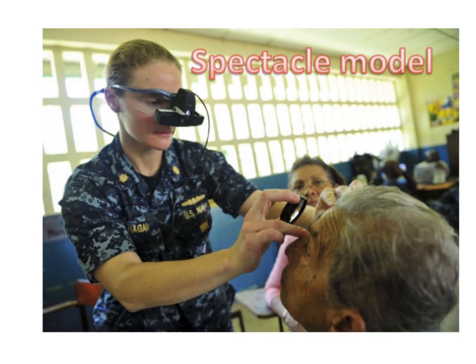It takes a lot of time to get the image, and this particular procedure is slightly difficult when compared to the direct ophthalmoscope, and you need a lot of practice to visualize the inverted real image of the retina that is going to be formed in between the condensing lens and the examiner's eye.